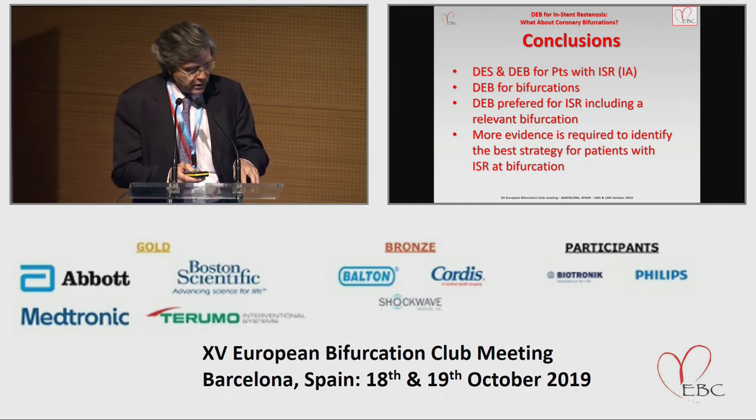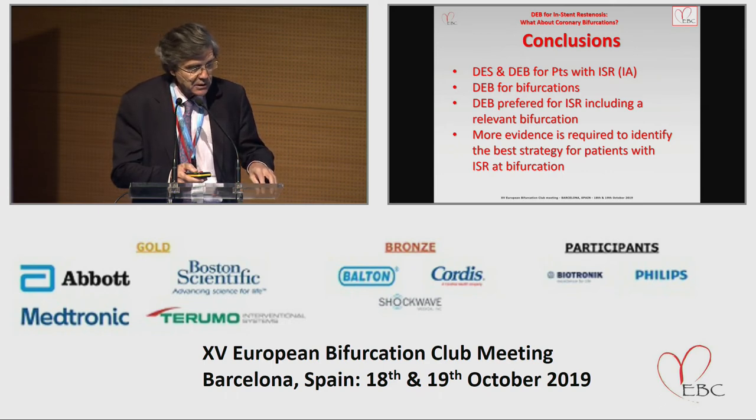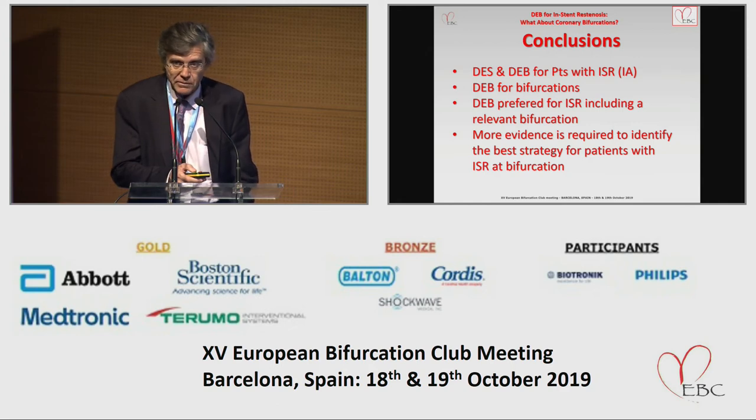I think when the in-stent restenosis encompasses a major side branch, well, then trying to finish the work with the drug eluting balloon alone strategy is very, very attractive. But obviously, we need more evidence to identify the best strategy for these patients. Thank you very much for your attention.